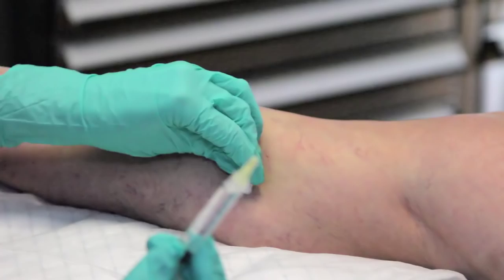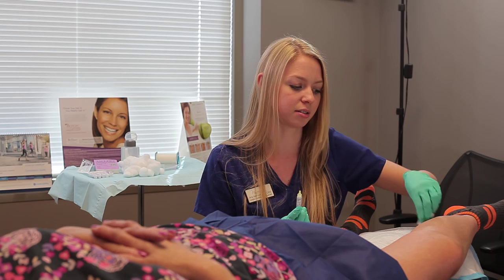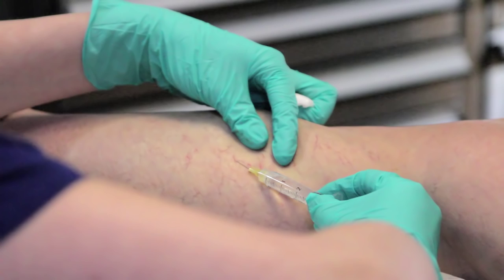The goal for sclerotherapy sometimes can be to do as few injections as possible, just for patient comfort. And you can watch it travel right throughout.